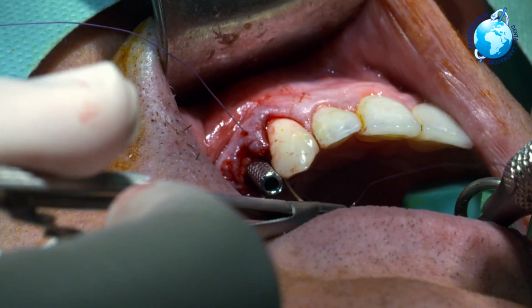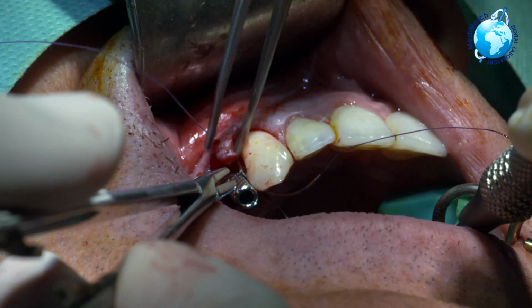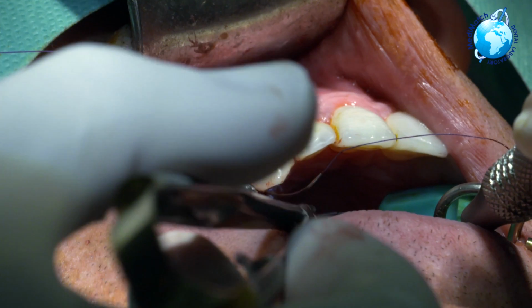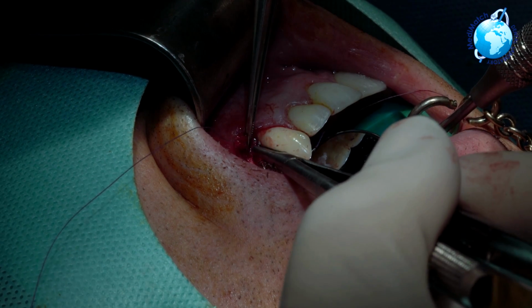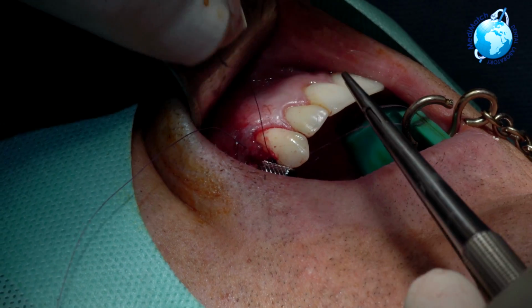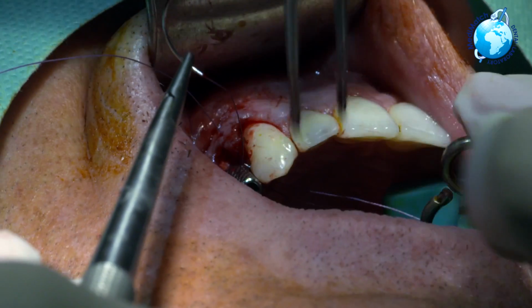Oh, I'm through. Alan, deep breath for me, sir. Breathe. What's the SpO2 reading, please? You are now, Alan, yeah? 97.50 now. It's just a mild bradycardia because Alan's very fit. He's got a nice low heart rate, which is good. Just a sec.